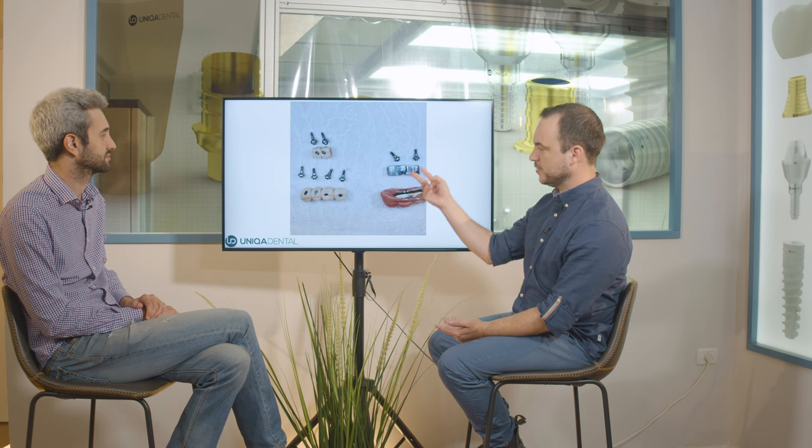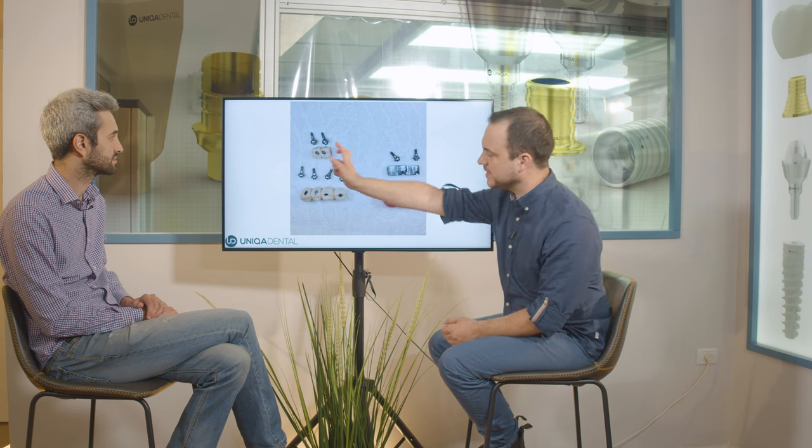The one that's missing — you need to extract the tooth. We have a bar on two multi-units and a small partial overdenture on this bar. We have a four-crown bridge on four multi-units and four implants. And we have a two-unit bridge — two premolars on two implants. You can already see that the implants are very close to one another, so we knew we'd have a problem in the impression-taking process.